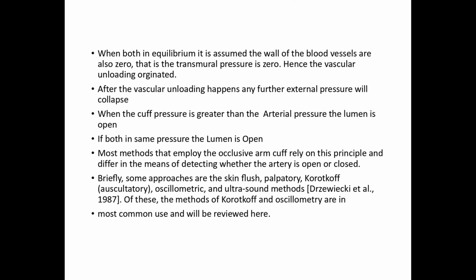The pressures in the blood vessel and outside are in equilibrium. Maintaining that is vascular unloading.